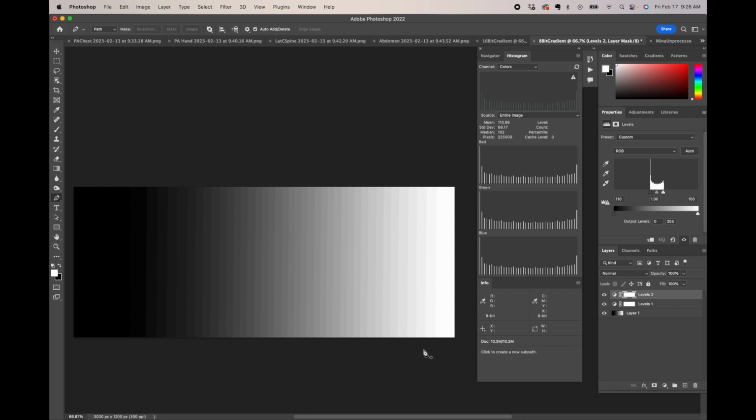So in photography, I always shoot raw, and then I make all of my adjustments in 16-bit, even though the camera may not be creating a 16-bit file. It may only be a 12-bit file. I still make my adjustments in 16-bit, then convert to 8-bit. So how does this matter in radiography?